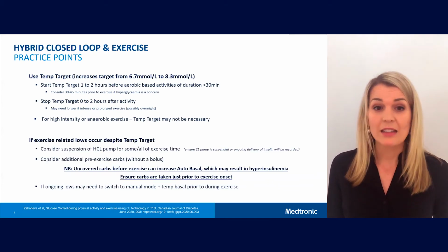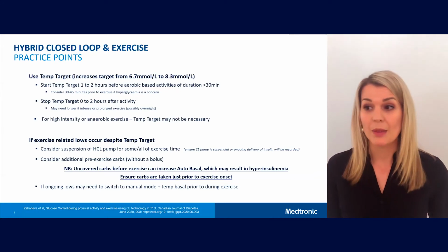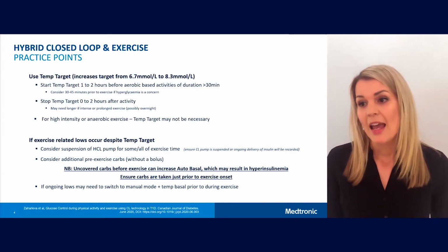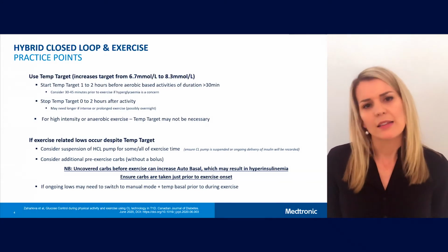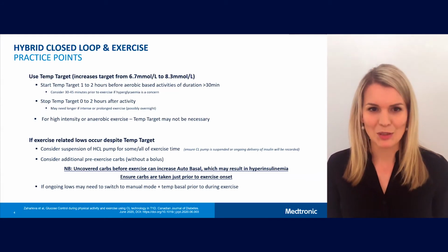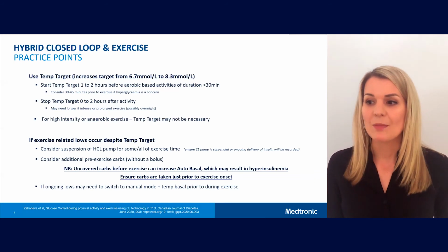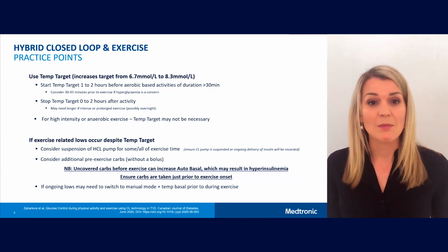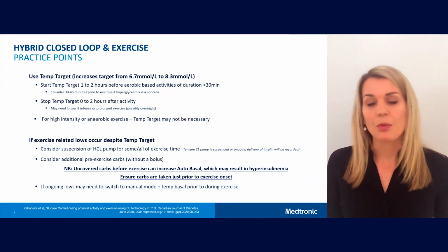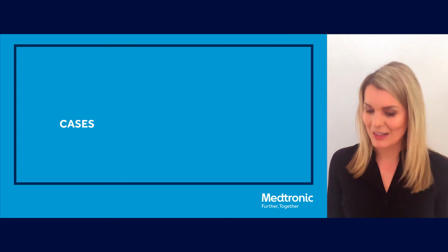If exercise-related lows occur despite the temp target, consider suspension of the pump completely as well for some or all of the exercise time, and also consider additional pre-exercise carbohydrates, again to be given as close to the exercise as possible. If ongoing lows occur, then the person may need to switch to a manual mode and use a temp basal prior to the exercise and during. So let's look at some cases.